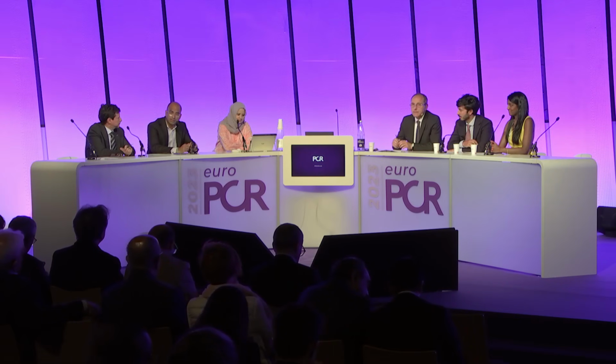To clarify, that's putting in the wire while you're doing the rotablation and all kinds of crazy things you can do to protect the wire. But once you've done the rotablation, of course, you should have the wire in the side branch so that you know where it is. And all the standard jailed wiring issues, I think this is best practice at this point. Don't leave big side branches like that unwired.